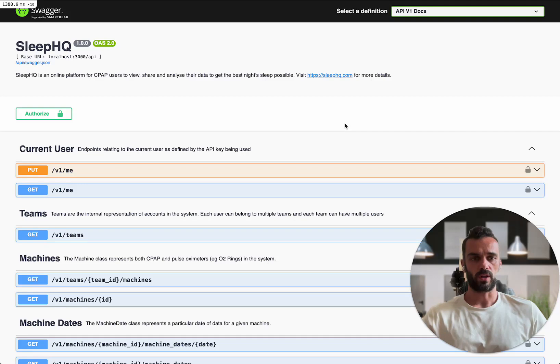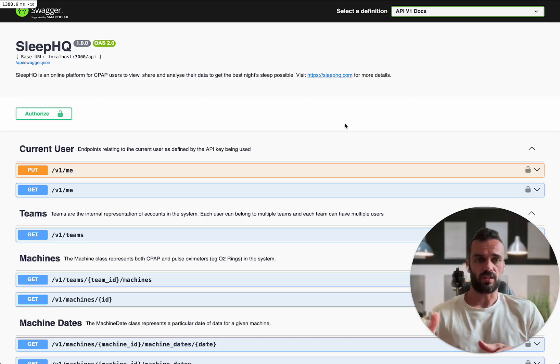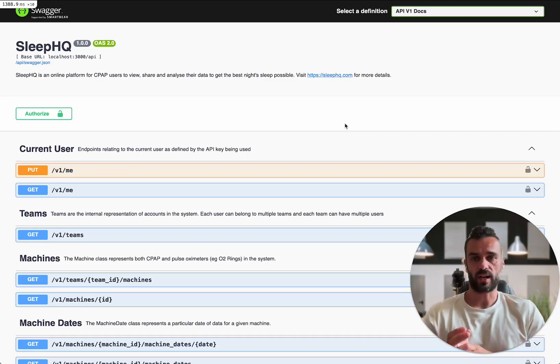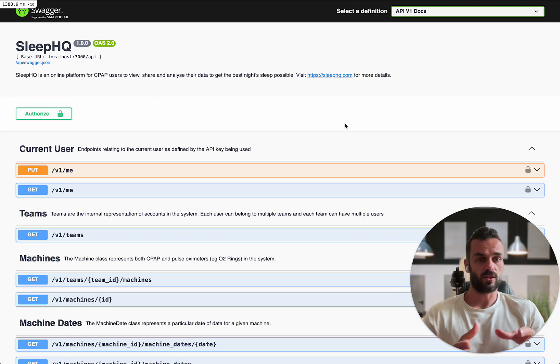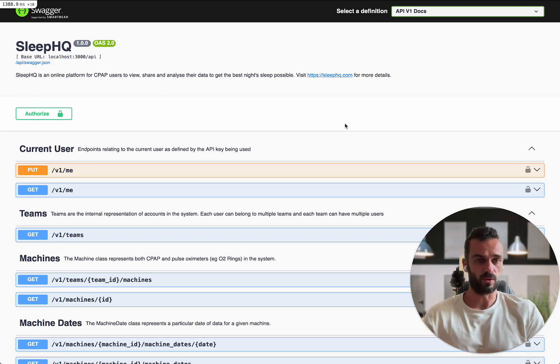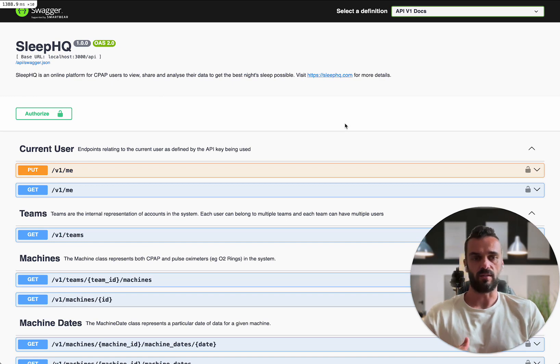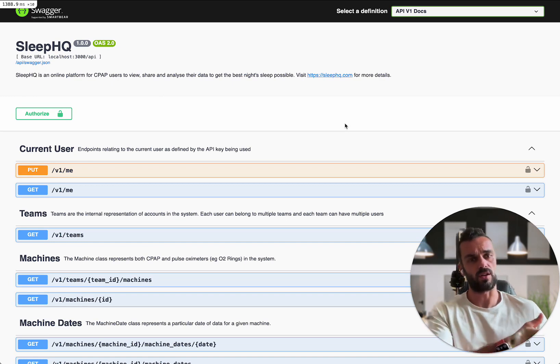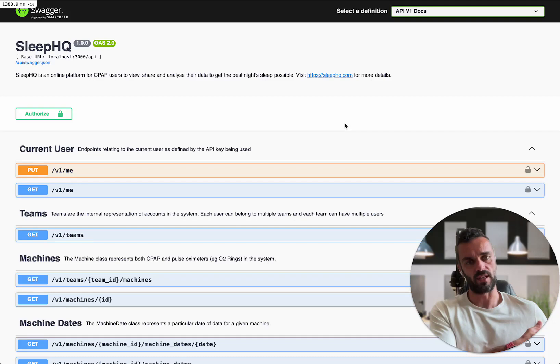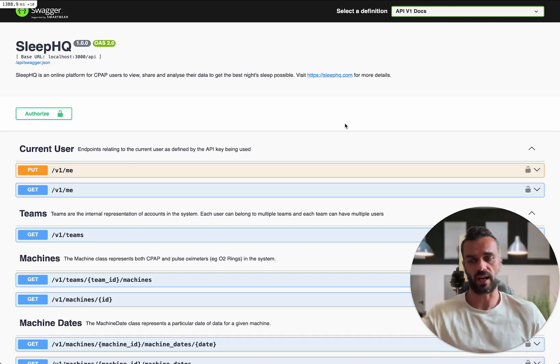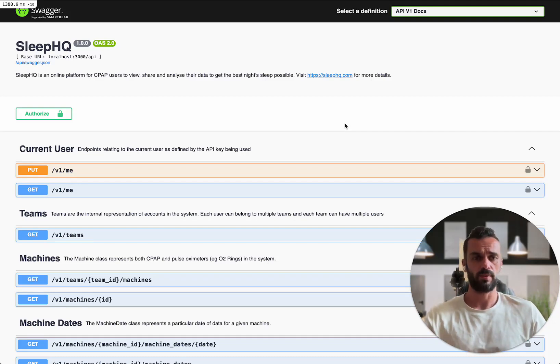What's really cool with this documentation though is it's interactive. I can actually execute these API endpoints directly through the browser to see what sort of responses I get and to test them out and make sure that everything's working so that I can go and implement it in my own application. So let me show you how that works.